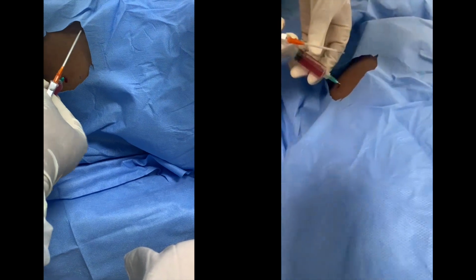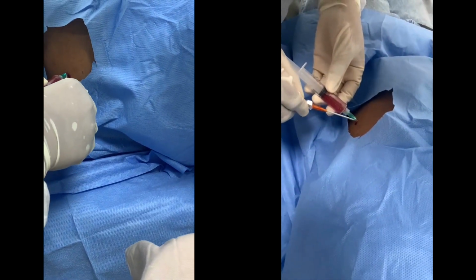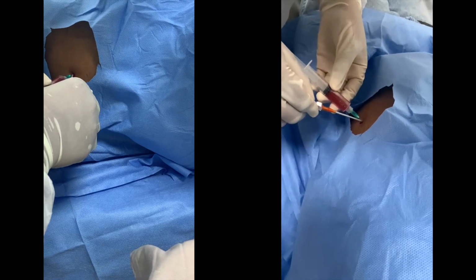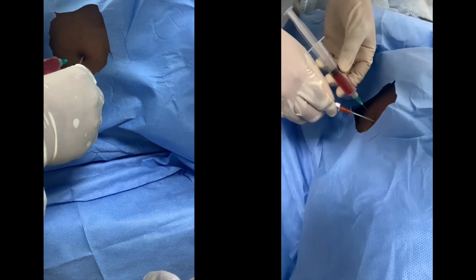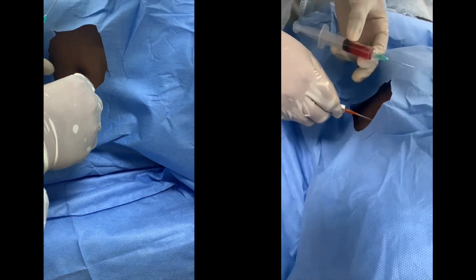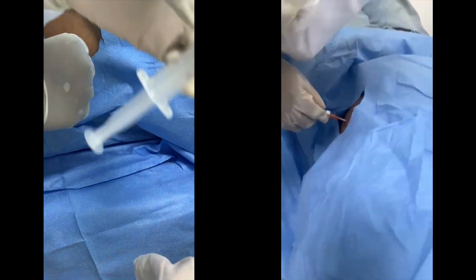So I put that in, and then I aspirated and saw that there was fluid. So the IV needle that I am going to be using to tap this patient, I put it directly where I pulled out my needle from, and then I just connected the line.